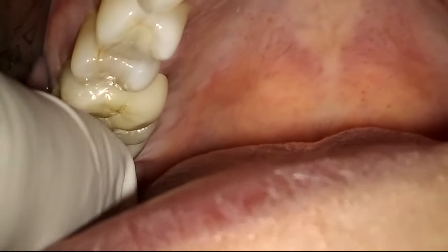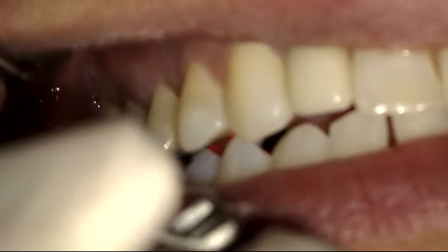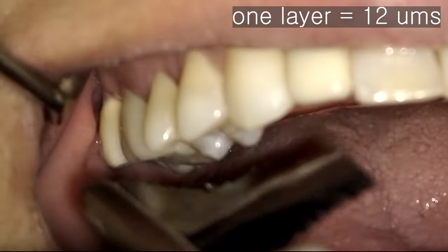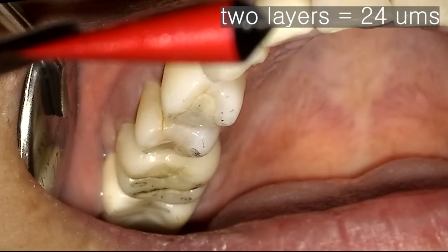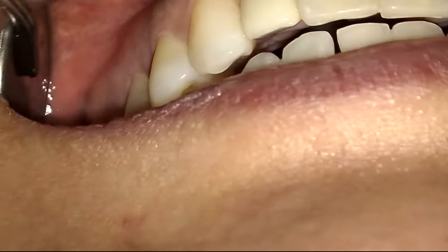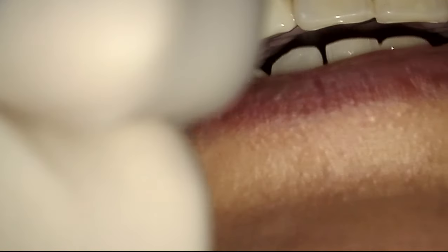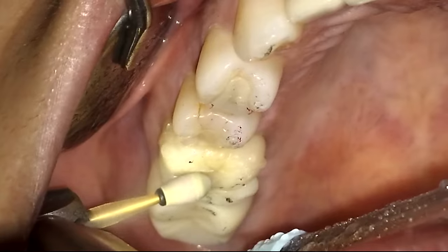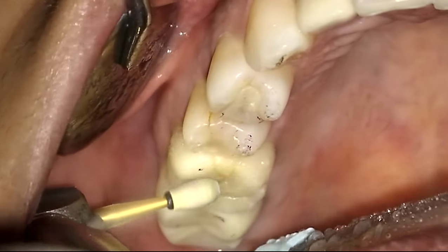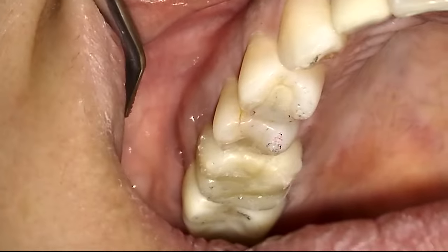I want to check a case where I didn't anticipate and made an error. I placed the crown and checked the occlusion. A single sheet of 12-micrometer-thick occlusal paper comes out easily in front of the crown. Folded once to two sheets — also comes out. Folded again to four sheets — gets stuck but comes out. Folded again for eight sheets total — finally it doesn't come out. So the crown is as high as between four and eight sheets, translating to about 48 to 96 micrometers. Adjusting the occlusal error took me about nine minutes — pretty inefficient.